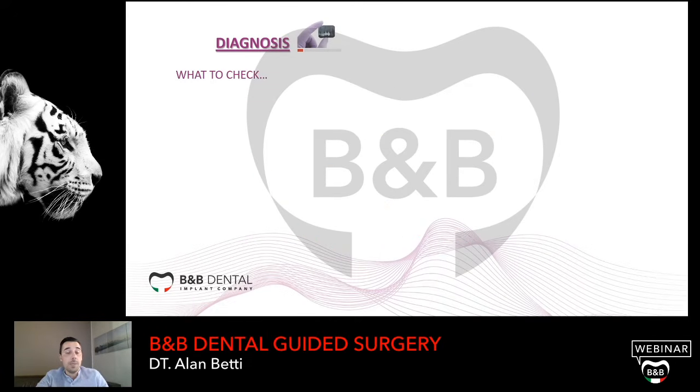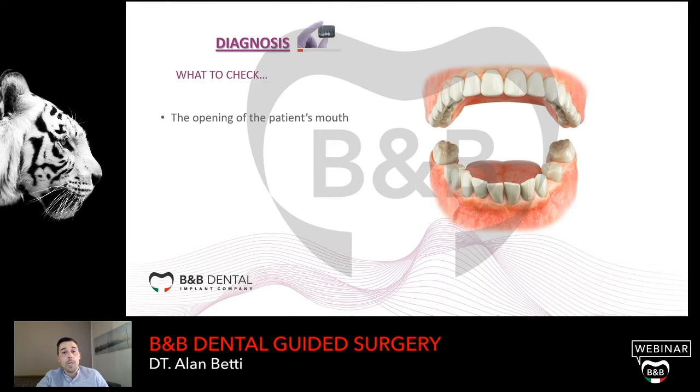So the first step is the diagnosis. What the doctor absolutely has to check before deciding to use this technique: the opening of the mouth of the patient, because the drills and all the components in the surgical kit for guided surgery are 9 millimeters longer than the drills for traditional surgery. So if the patient doesn't open the mouth enough, you can't use this technique.